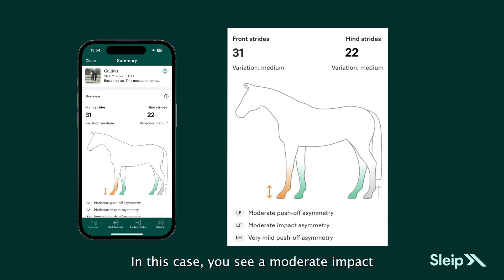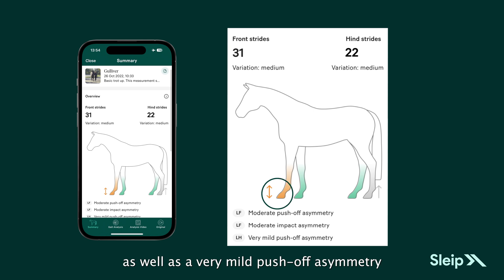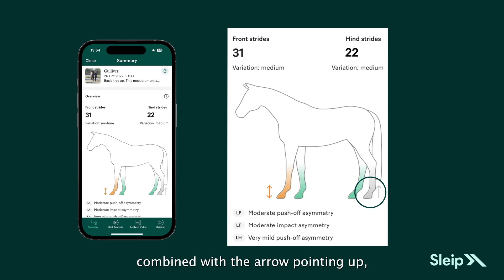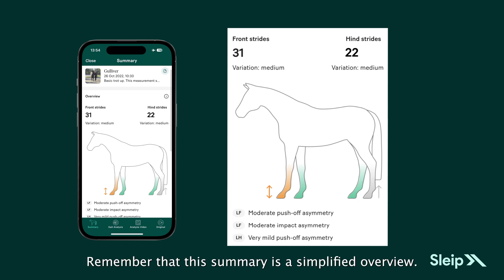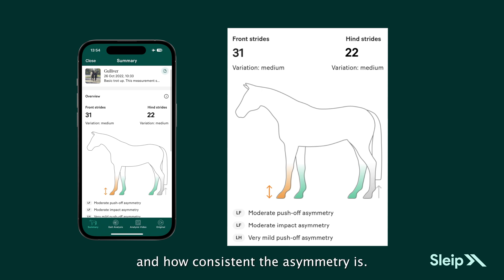In this case, you see a moderate impact and push-off asymmetry originating from the left front, as well as a very mild push-off asymmetry from the left hind. The gray-colored left hind limb combined with the arrow pointing up indicates a very mild push-off asymmetry. Remember that this summary is a simplified overview — always look at the detailed analysis and how consistent the asymmetry is.